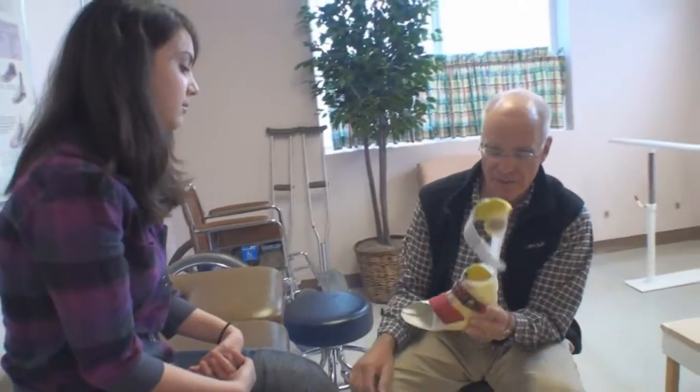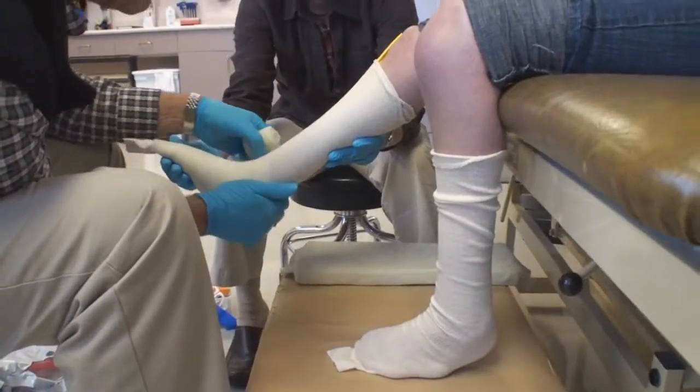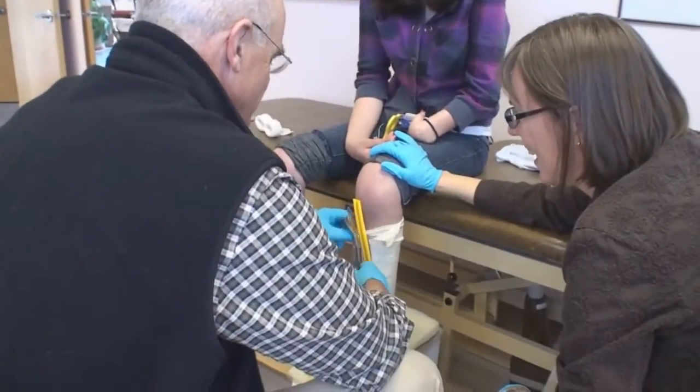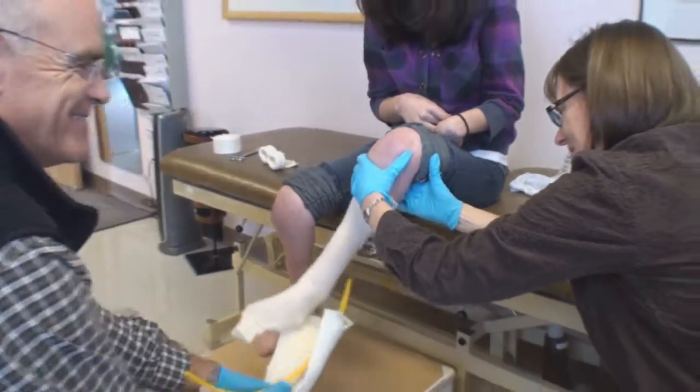Once we've decided on a style of brace, we measure the patient with a cast where we wrap her leg in a fiberglass casting material, similar to if she'd broken her leg. That gives us a three-dimensional measurement of her leg, and I also apply a correction because the brace needs to hold her foot in the best position of function — the foot will be nicely balanced and the ankle will be in a position where the weight is over the foot.